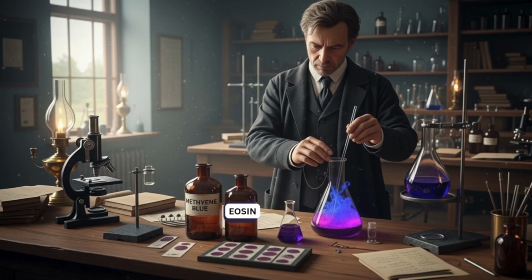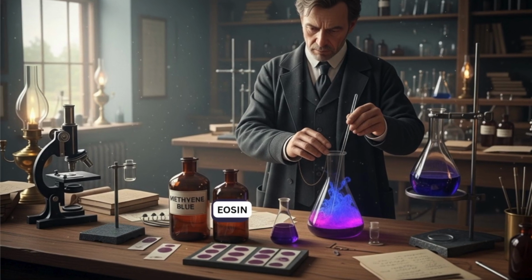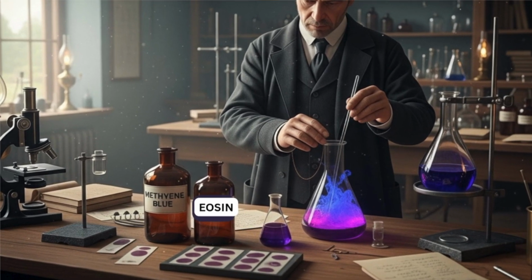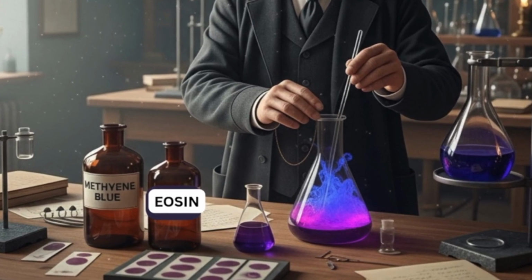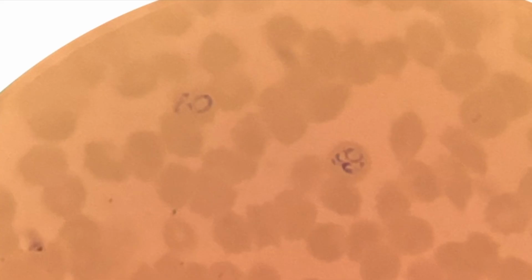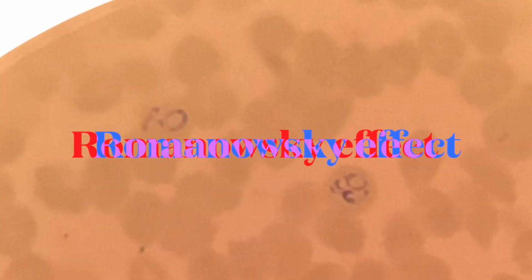In 1891, Dmitry Leonidovich Romanowsky made a key discovery. He combined methylene blue and eosin. Unexpectedly, he observed a distinctive purple coloration in malaria parasites, something neither dye produced alone. This became known as the Romanowsky effect.